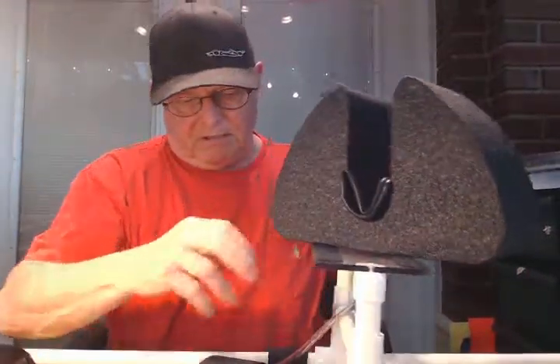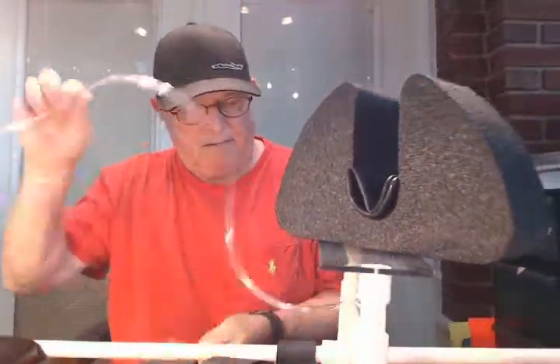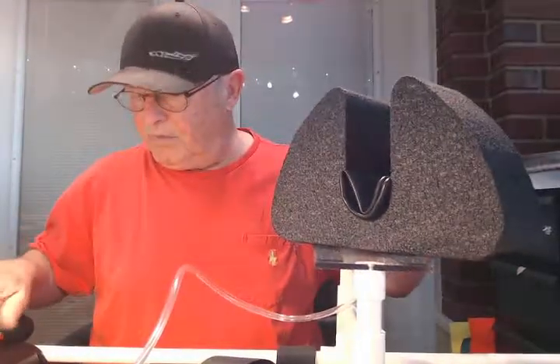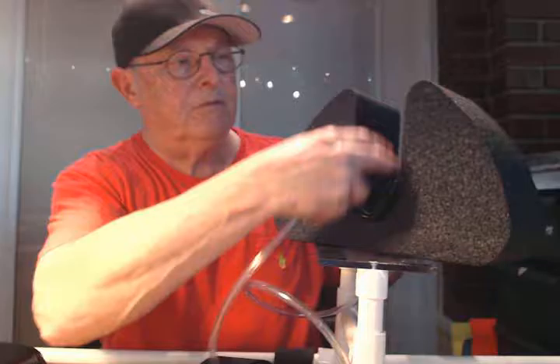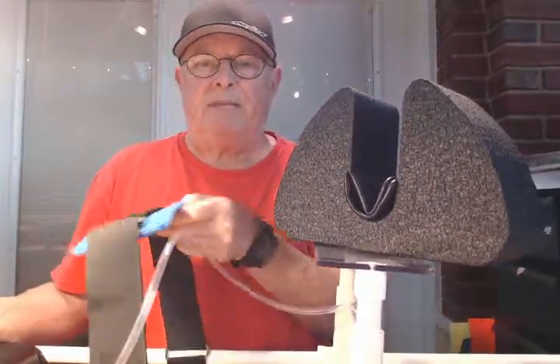So you put your heel up in here and it's elevated. Then you take this little bladder — you put your heel here so your foot doesn't evert. Then you pump it up, and you put this pad over the top of your knee.